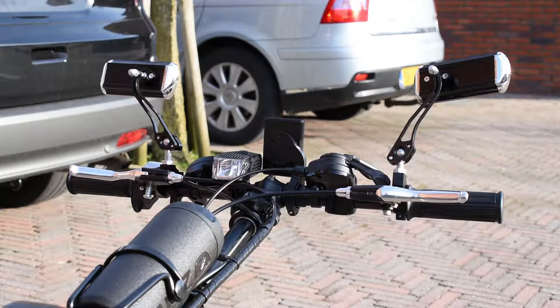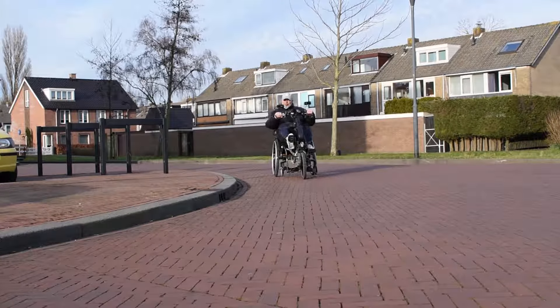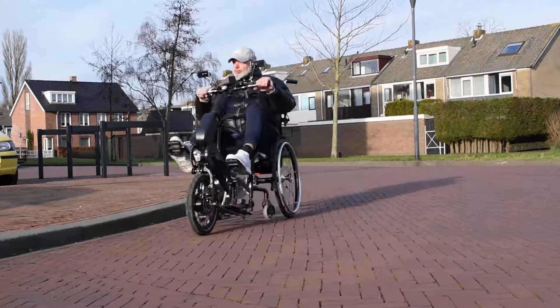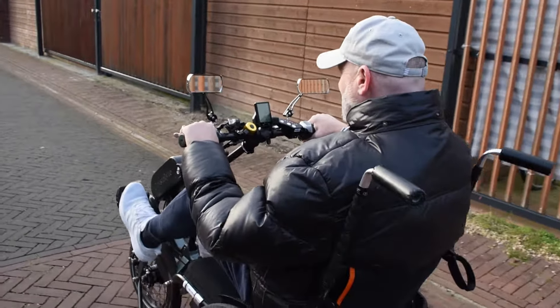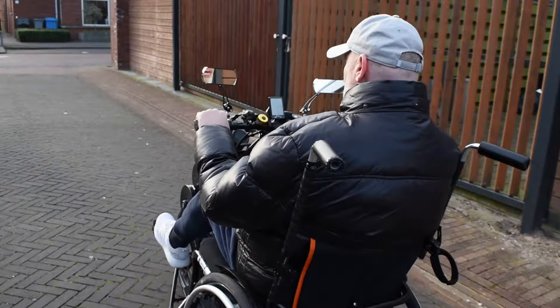A bike trainer and a side mirror are among the comprehensive accessories of the EasyLegs Connect. Equipped with 8 or even 11 gears and a disc brake, it's a luxury and sporty tricycle bike. The bike is made of lightweight aluminium and contains quality parts, such as a Schwalbe tire.